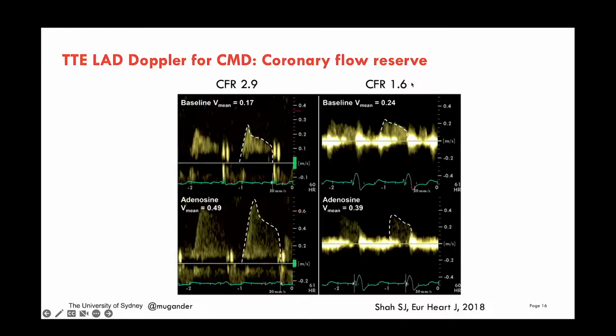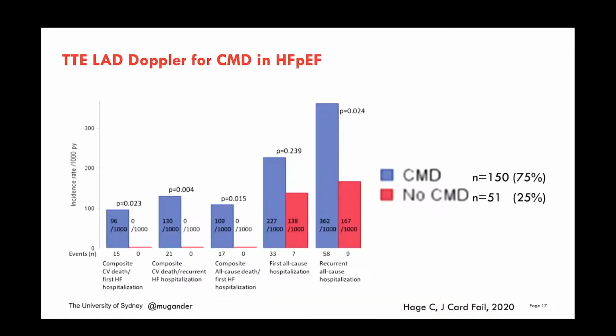And that's an interesting method because of its greater availability compared to PET and SPECT, but you sort of need to know that the patient has the absence of stenotic disease, which may be known from an invasive coronary angiogram or a CT coronary angiogram, and you want, on top of that, to confirm or rule out microvascular disease, or in this case, to do research.